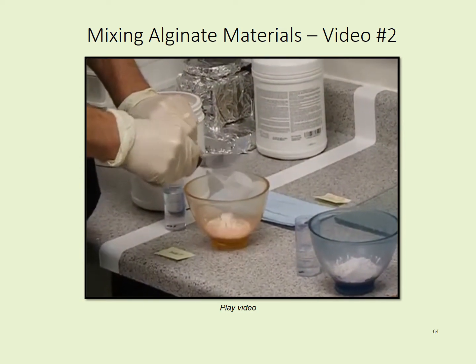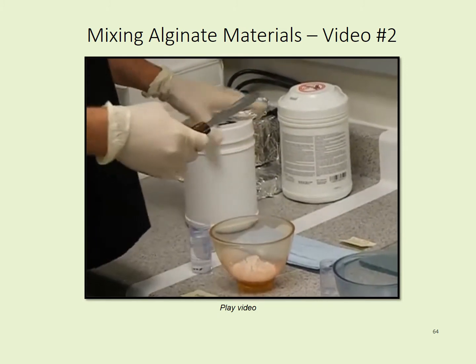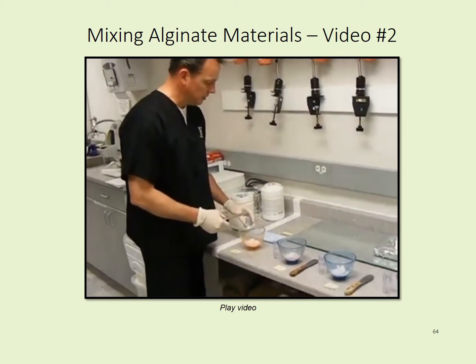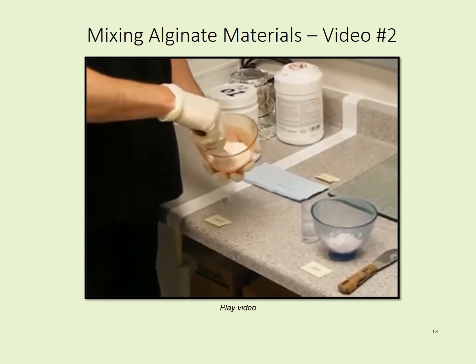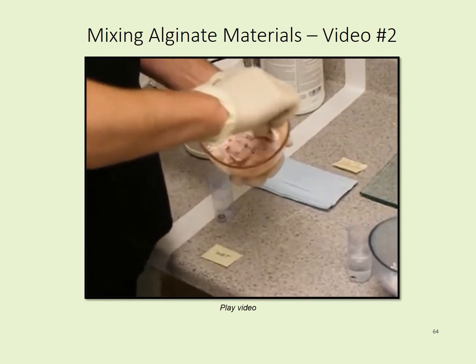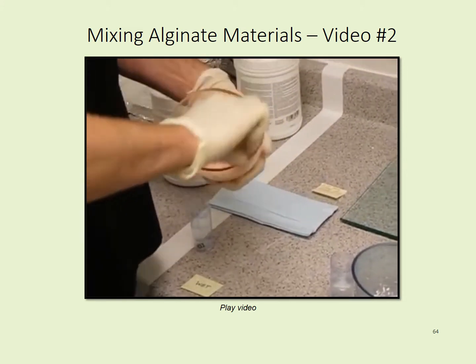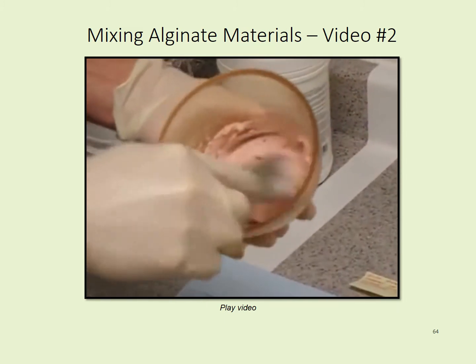Now this particular alginate calls for equal measurements of both alginate and water. And so in the wet mix we have a little bit more water. I'll demonstrate what happens in the wet mix. The initial wetting process goes very, very quickly. All the dry spots in the alginate disappear, but the alginate is left with a very shiny sheen and kind of a chunky look to it.